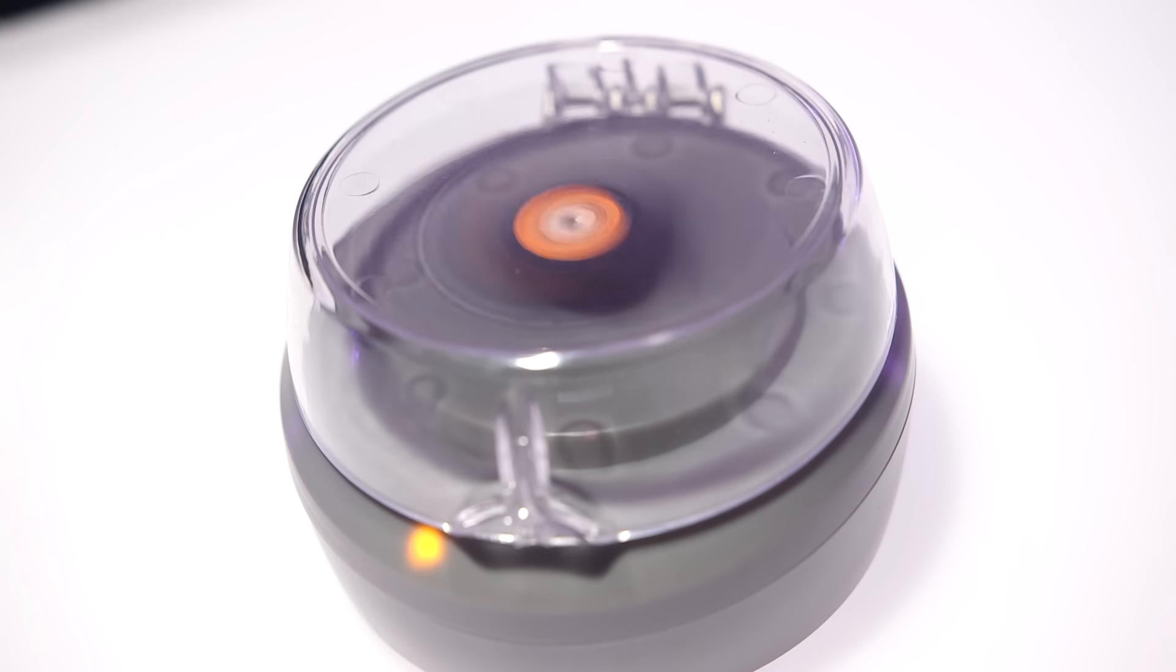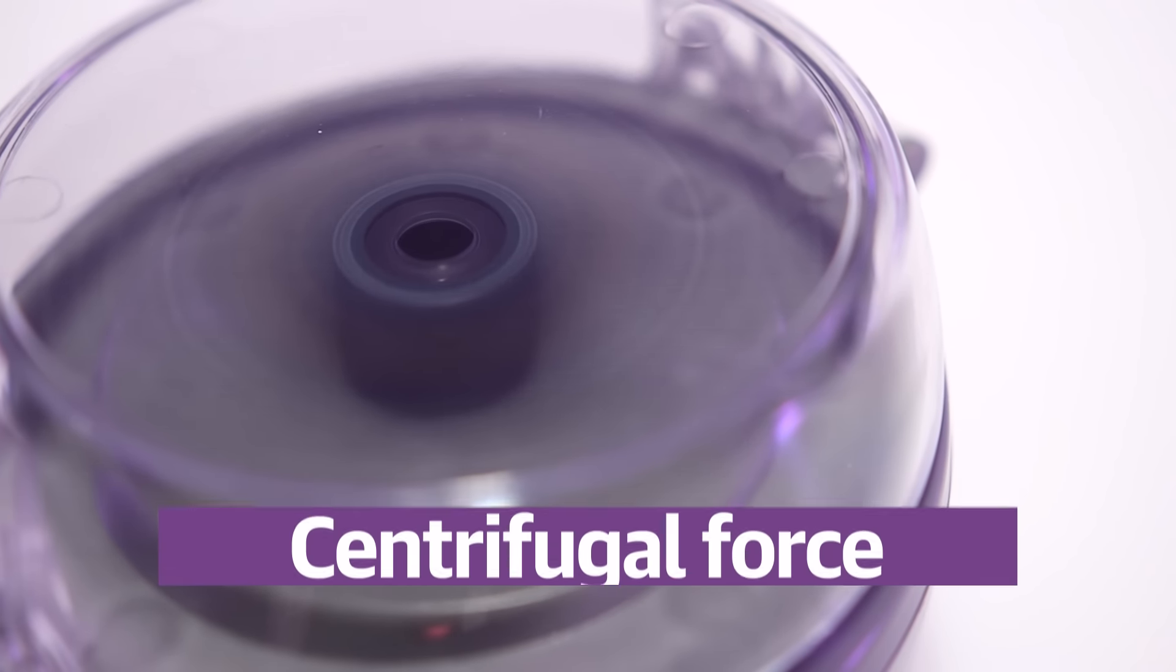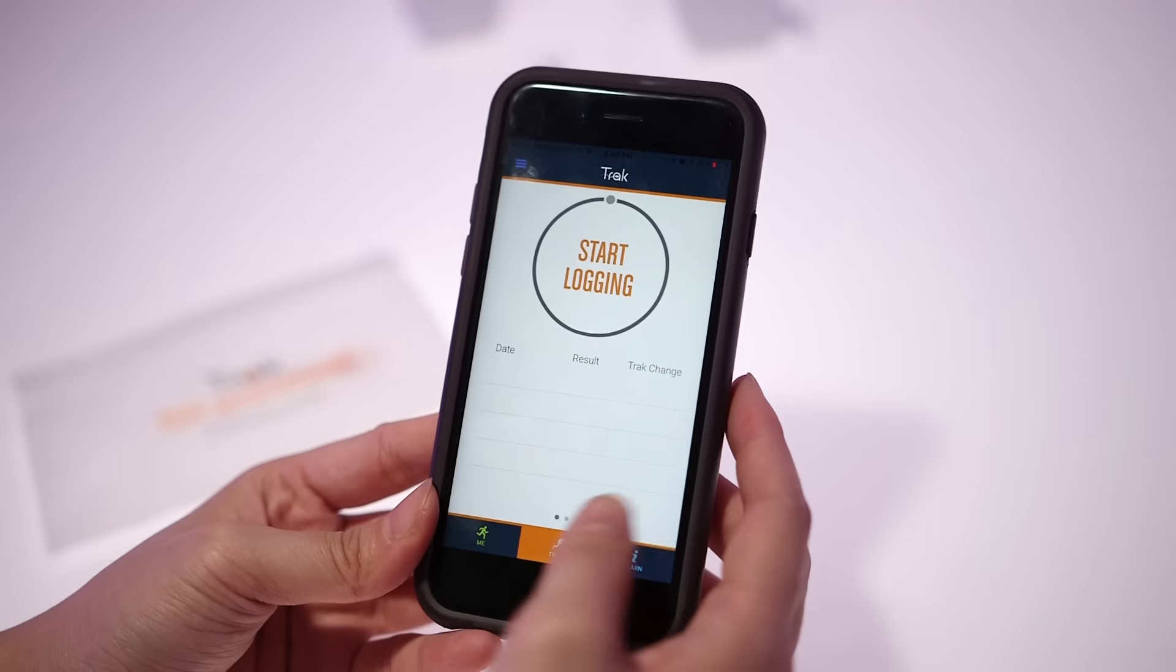That triggers the device to start spinning, and that centrifugal force separates the sperm and lets the device isolate and quantify sperm cells. After six minutes, that's done and you can log your results in the companion app on your phone.